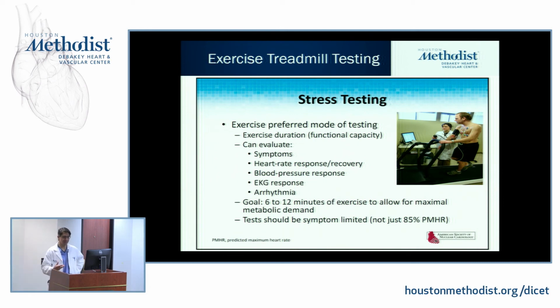We learn a lot from when patients exercise. We learn about the symptoms that they're having when they're exerting themselves. We can see blood pressure responses. We can see how much they're able to exercise. We can see EKG changes and whether they're having arrhythmias or not. We can see their ability and how long they can exercise. So it's an extremely important and useful technique to stress patients.